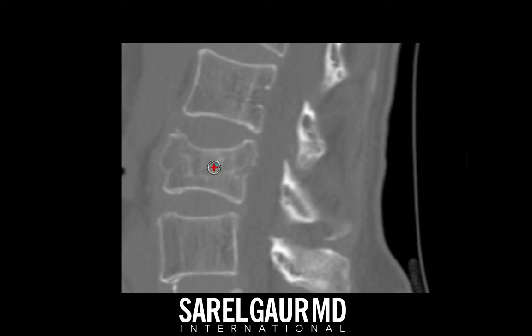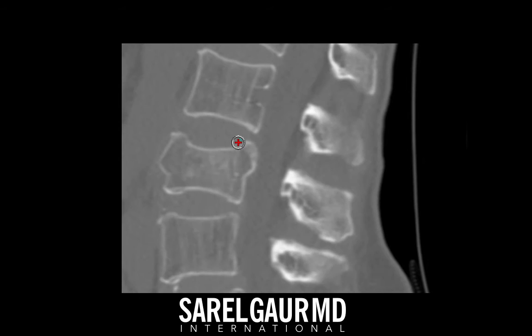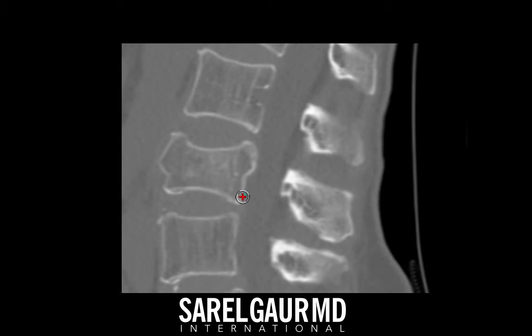Looking at the trabecular bone, you can see lucency and also some sclerosis from compression along the fracture plane. The next thing to think about is whether there is retropulsion — are fracture fragments extending posteriorly and causing mass effect or impingement on the central canal, possibly injuring the cauda equina nerve roots? In this case, there is some very mild retropulsion in the posterior aspect of this vertebral body without significant central canal compromise. I could confirm this finding on an axial view.